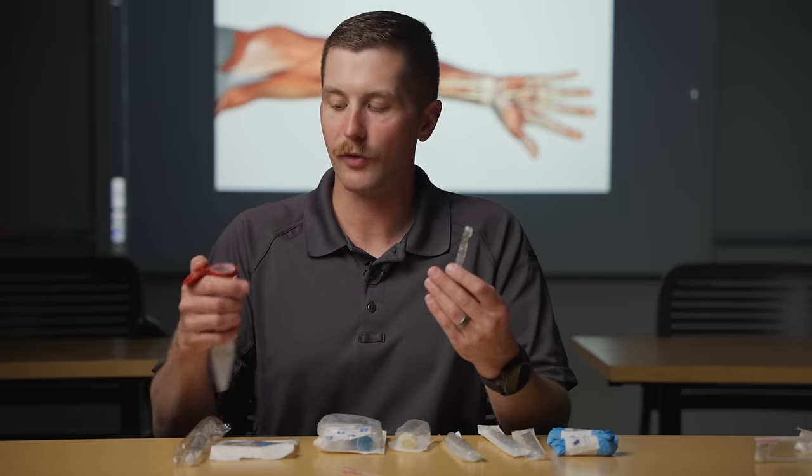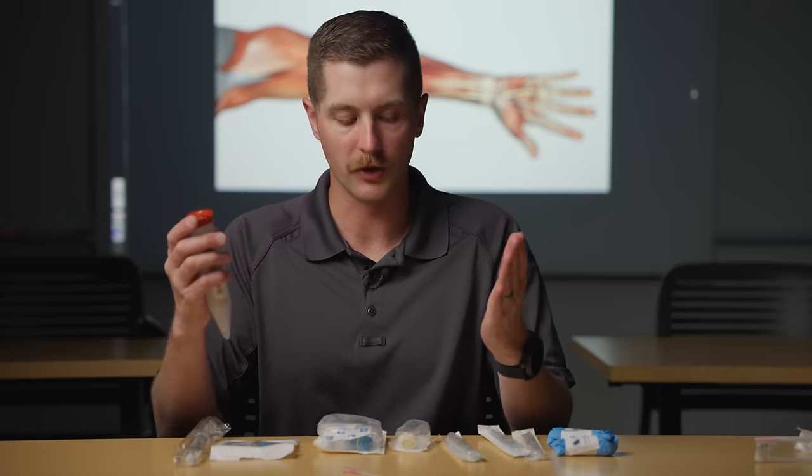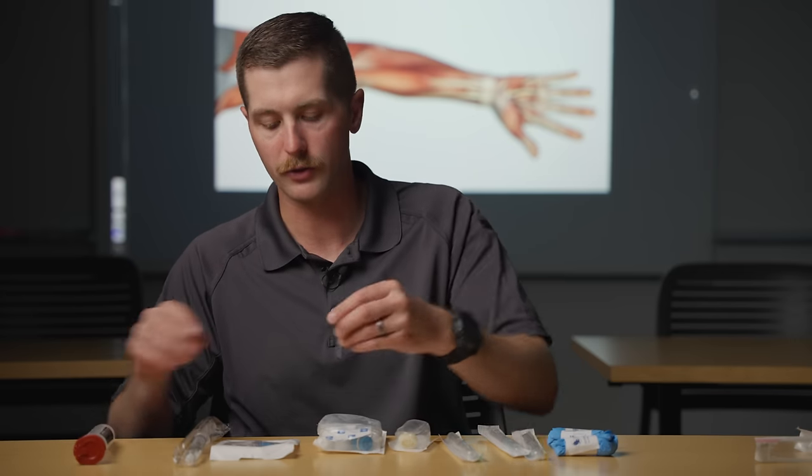We've got a sharps container here — we want to make sure we always dispose of our sharps correctly after we're done using them.